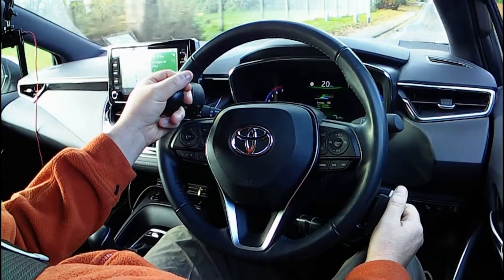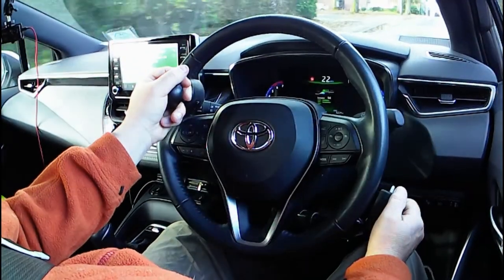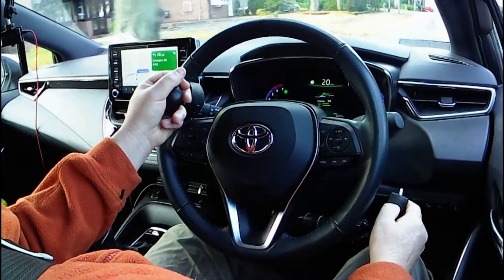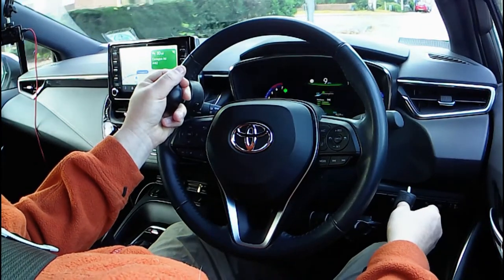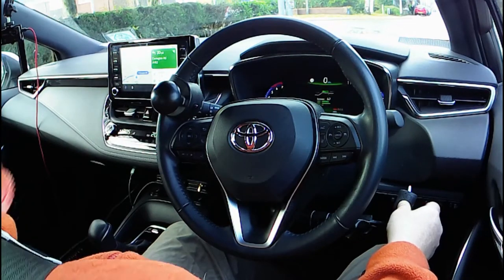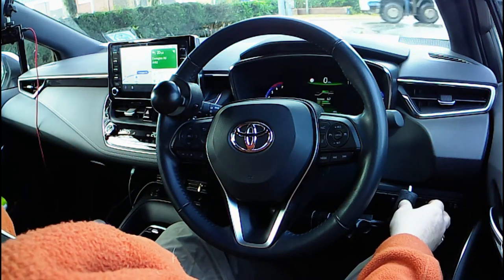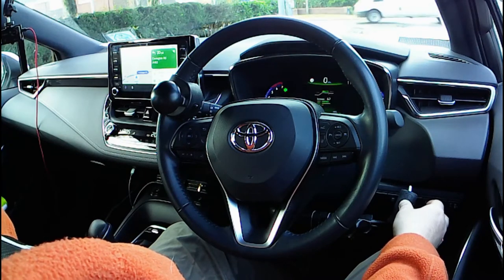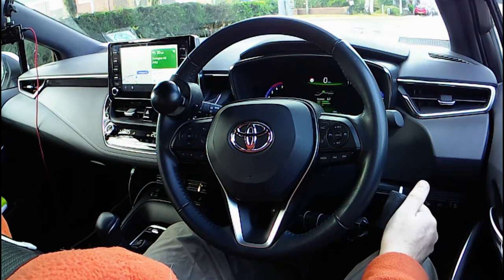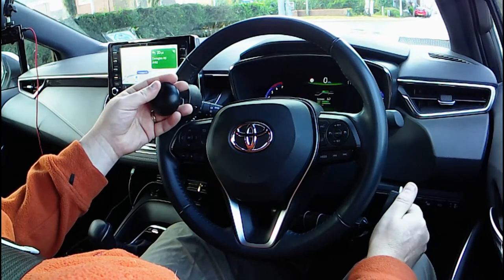I'll be turning left at the traffic lights. I can use either my thumb or an index finger or even the side of my index finger to signal. A little bit of thumb braking, more thumb braking because of the red traffic light. From here I can either keep my thumb on the brake or I can select neutral and apply the parking brake. And then when I'm ready to move, I simply select drive and pull on the accelerator with my fingers.